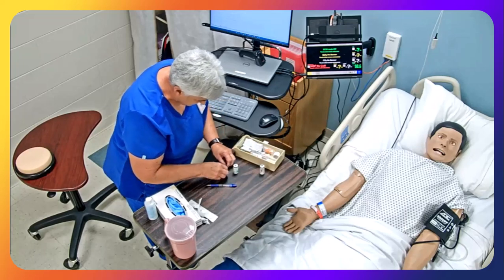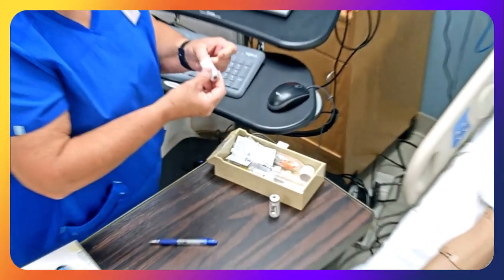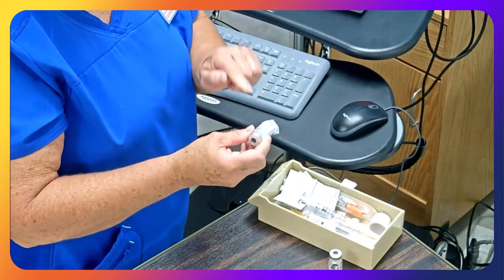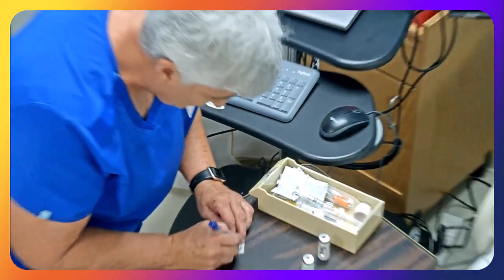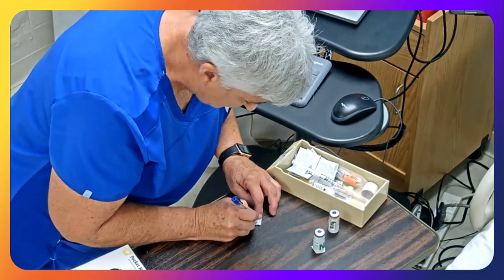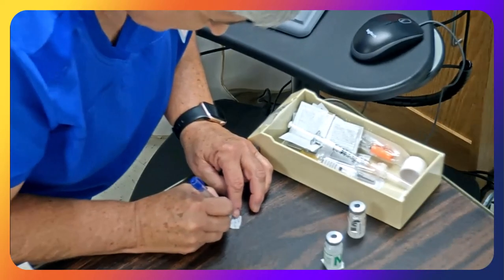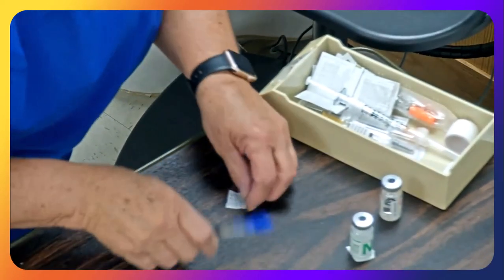Okay? That way the next person that uses this, when they use it, they've got to check, make sure it's still within the time frame here and the vial is still good. And so we're going to do that with both. Time and my initials.